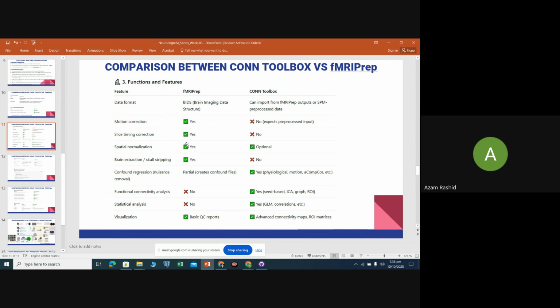But the raw data you collect is not up to the mark. When you do not have raw data in the correct format, how can you analyze it and provide the best analysis for that? In such cases, that's why I am training you people on fMRIprep pre-processing. It's just an easy task; the routines are just some bash scripts and three to four lines of Python coding. All the things are done in the backend.